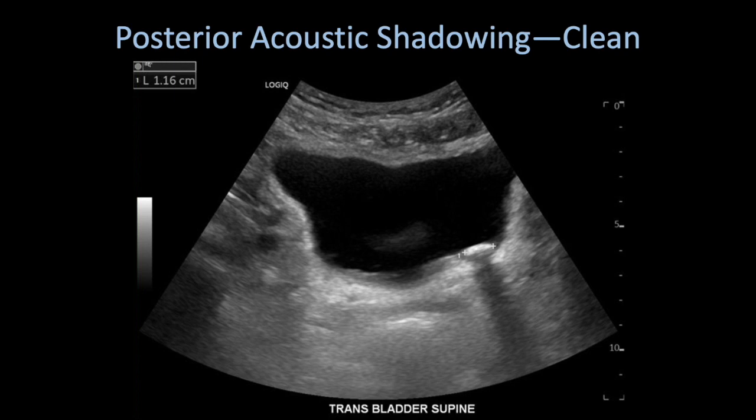In this episode we're going to focus on clean posterior acoustic shadowing. Clean posterior acoustic shadowing usually happens in the setting of calculi. In this example here you can see a bladder that contains an echogenic structure or layering bladder calculus with posterior acoustic shadowing.